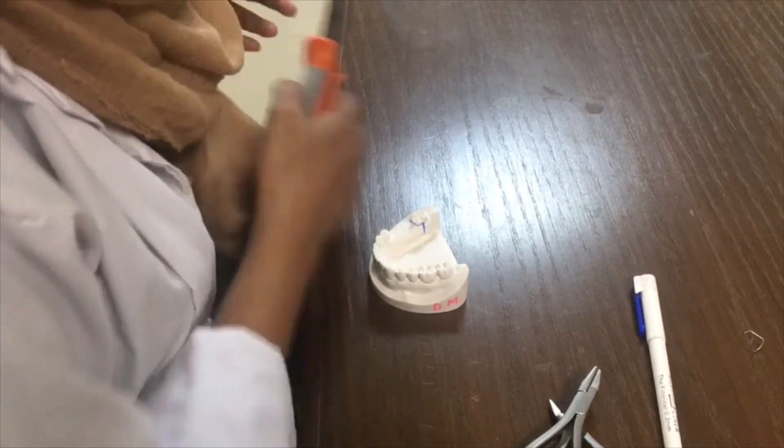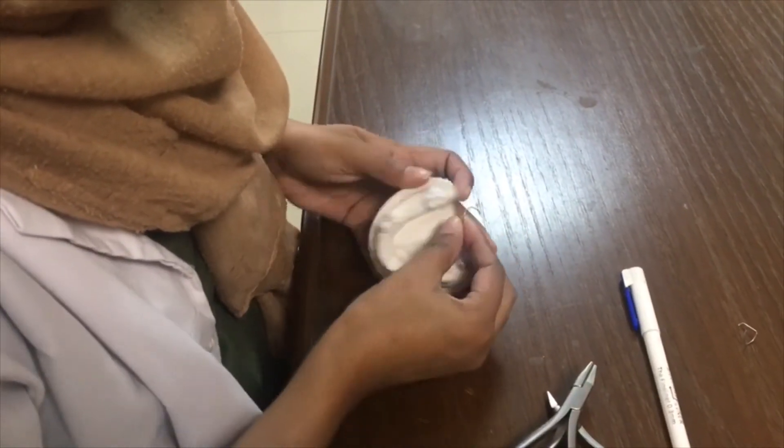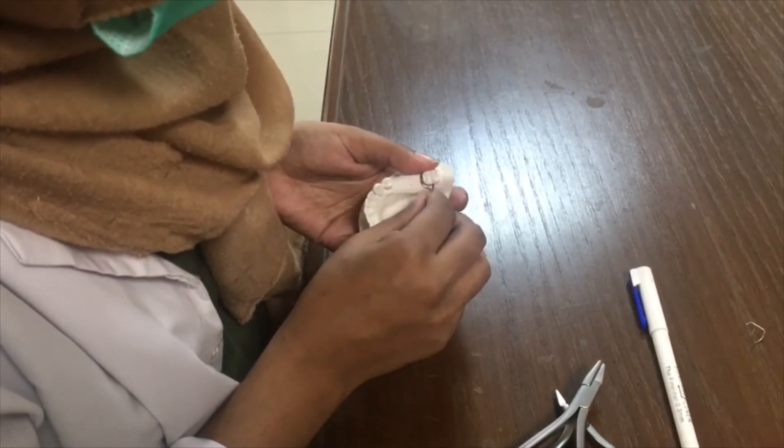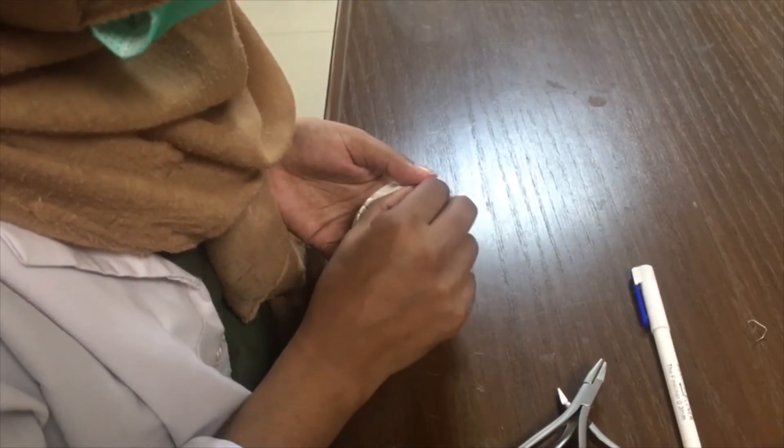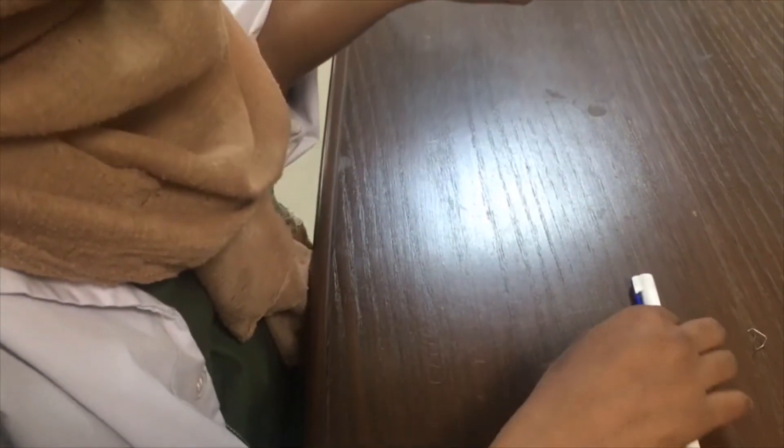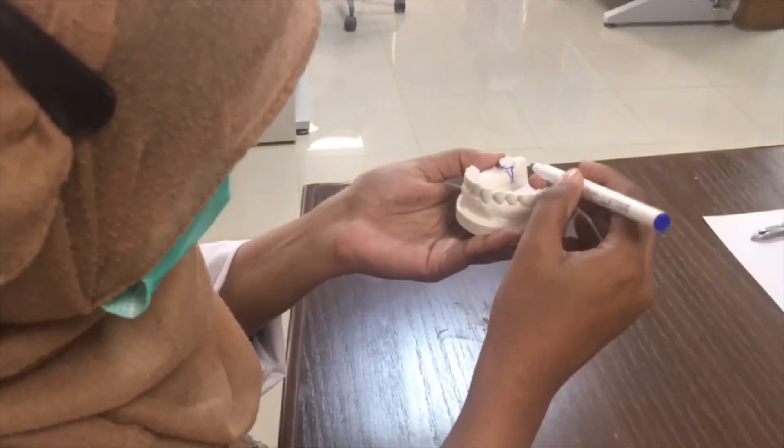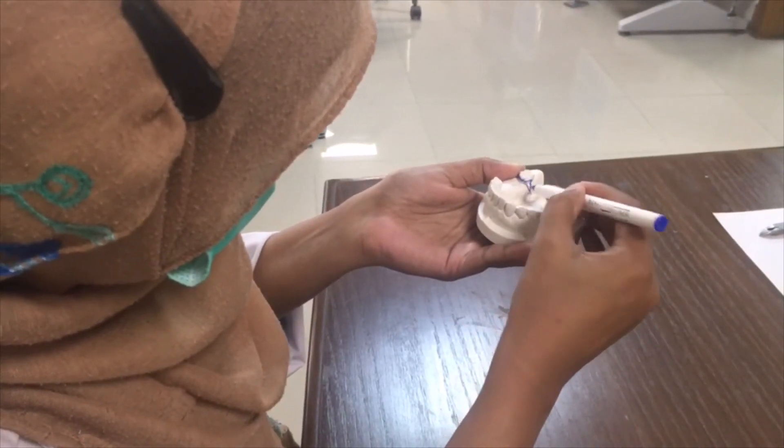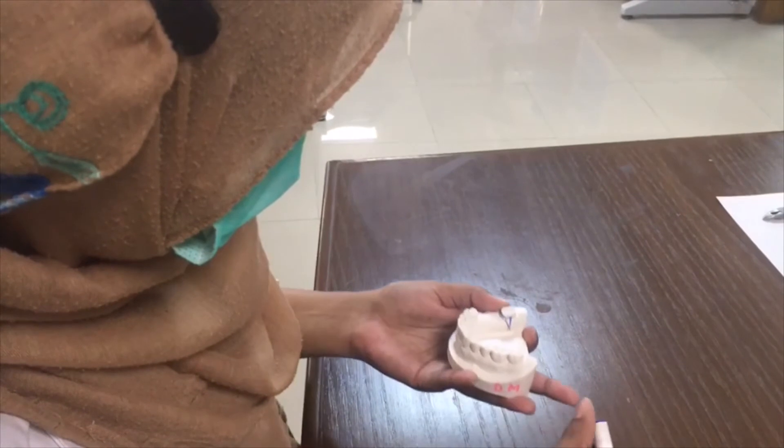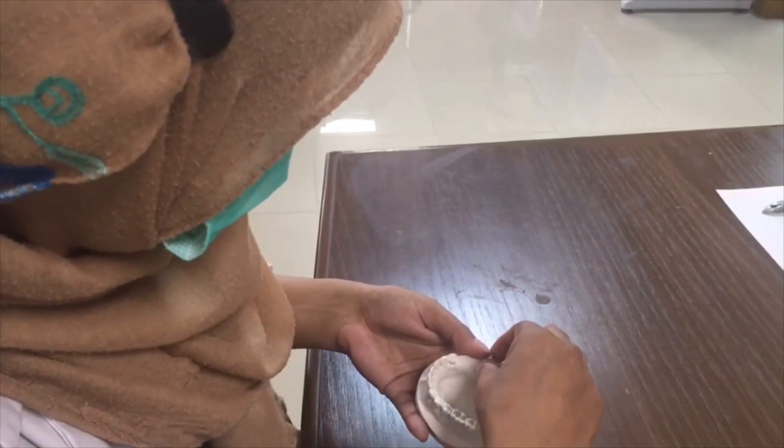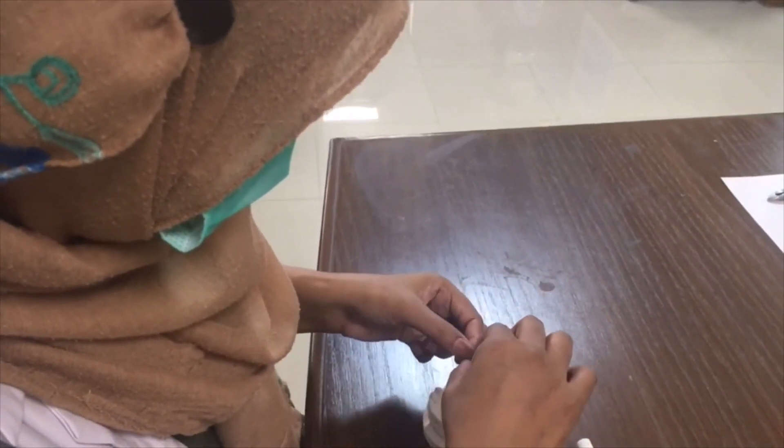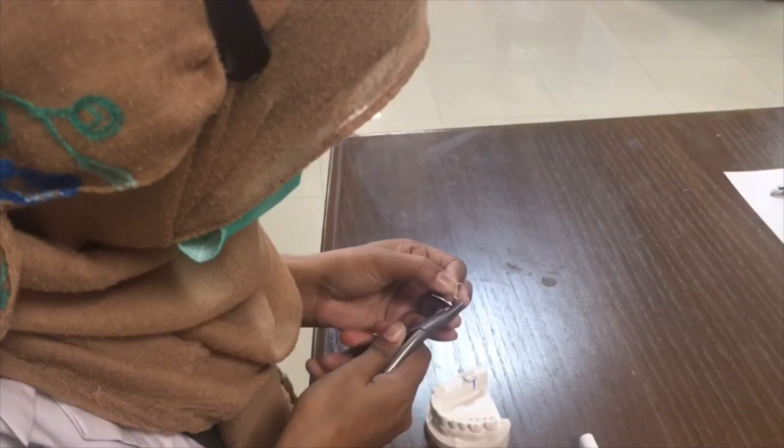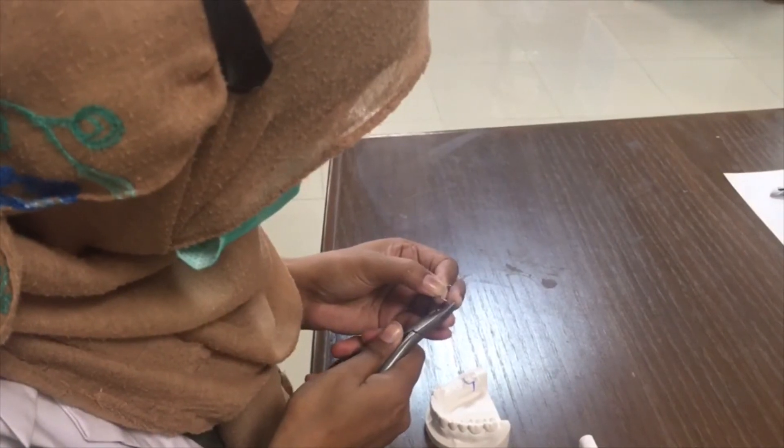You can cut any excess wire if it's coming in your way and then you can proceed again with the adaptation of the wire on the surface of the tooth. Keep on checking if you are bending it the right way and if it's being adapted properly or not.